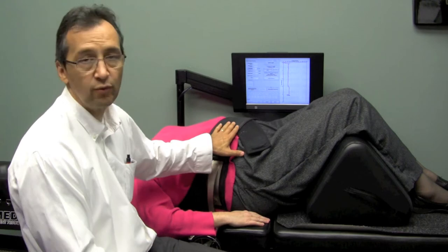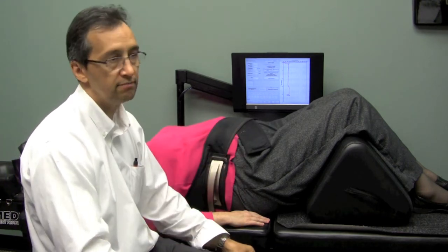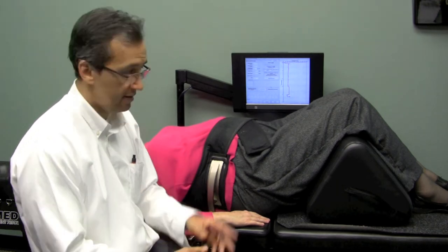I have her set up at 40 pounds. That's probably about the average amount I might use for a larger female or a smaller male to start with. The amount of tension will be increased in subsequent sessions until we decompress the spine enough that the person gets maximally improved.